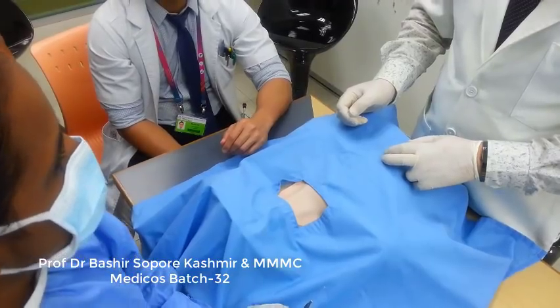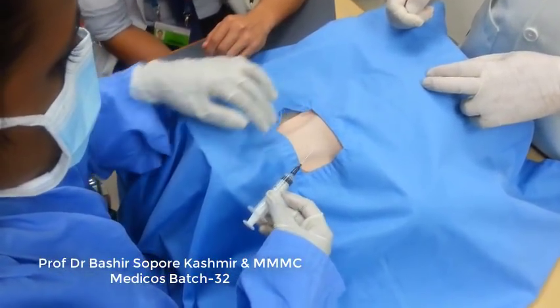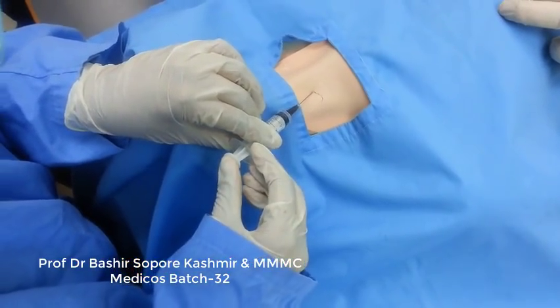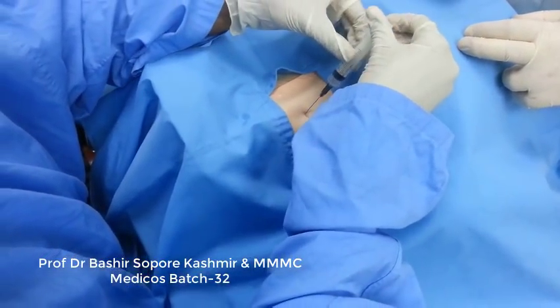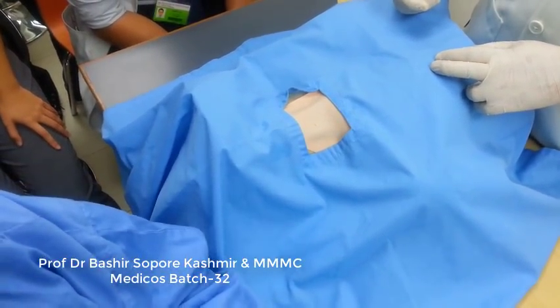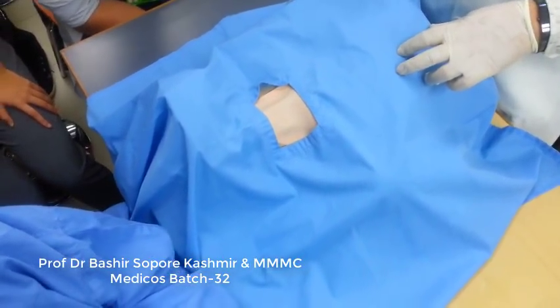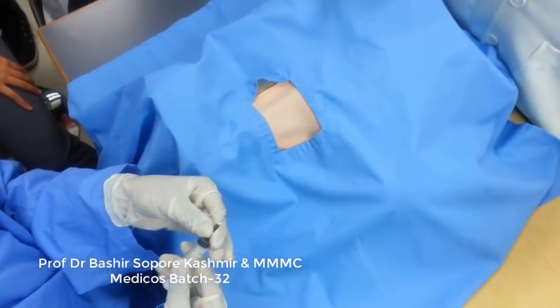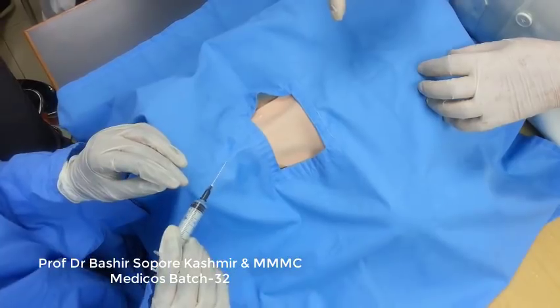So before you do the local anesthesia, in this area you will do the local anesthesia 1%, all 4 quadrants. Okay, done. After that, which needle will you take? A 22 gauge needle, which is called the finder needle. Usually the books and videos will show another needle, but no, you have to use the finder needle. It is also the thinnest needle, 22 gauge.